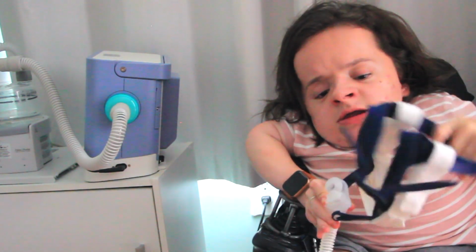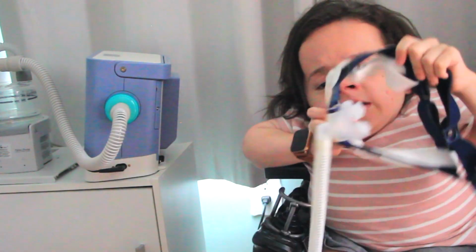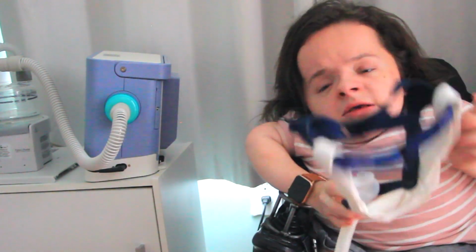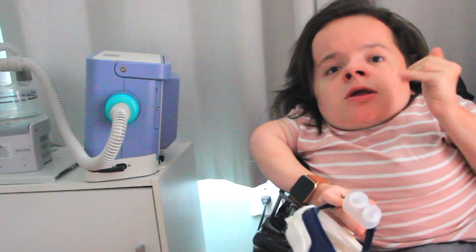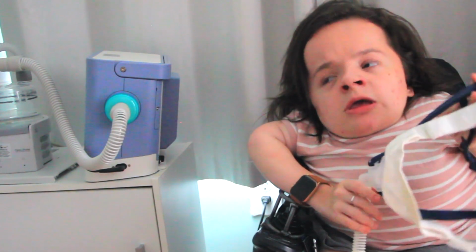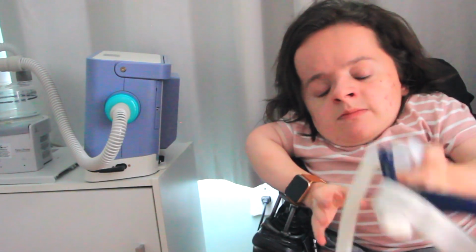This is my headgear. The blue part is called the headgear. This is the chinstrap, because when I get into a really deep sleep, my mouth goes open, but for some reason it's only when I'm in a deep sleep. Because of that, this helps keep my chin up and my mouth closed when I get into that deep sleep, because if my mouth is open and the air is going through here, then it will just go down my nose, out my mouth, and not go into my airways, keeping them open. So that's why I have this. Not everybody that wears one of these needs one. It's just for sleeping with your mouth open, but most people do at some point in the night. Mine is when I get into a deep sleep. And then this is the actual mask.